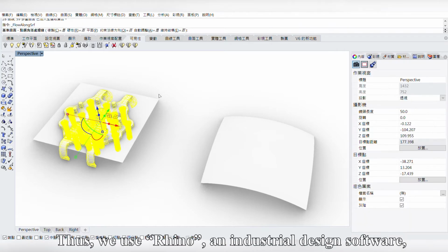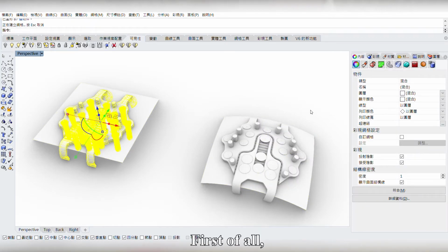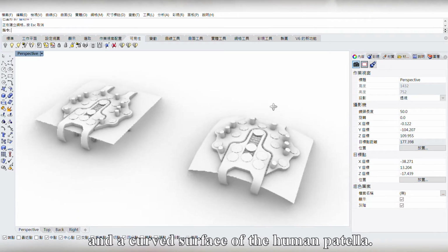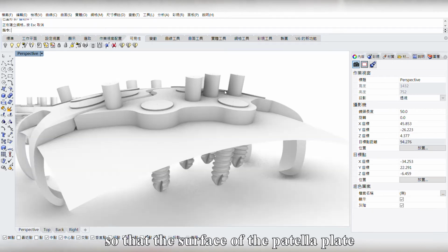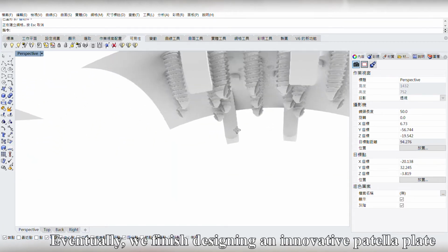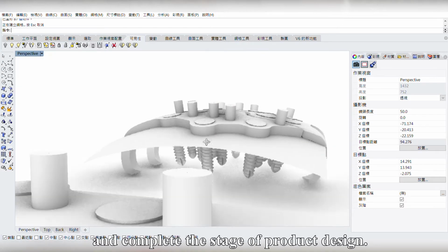Thus, we use Rhino, an industrial design software, to produce a curved surface. First of all, we produce a flat surface of the patella plate and a curved surface of the human patella. Then we bend the flat surface in Rhino so that the surface of the patella plate corresponds to that of the human patella. Eventually, we finish designing an innovative patella plate which meets clinical needs and complete the stage of product design.